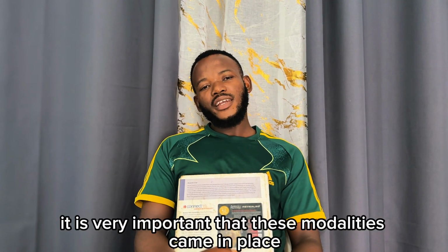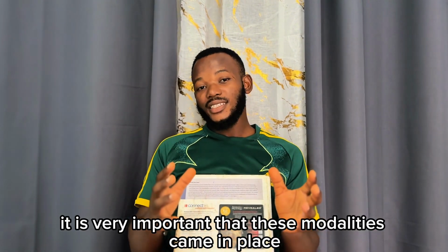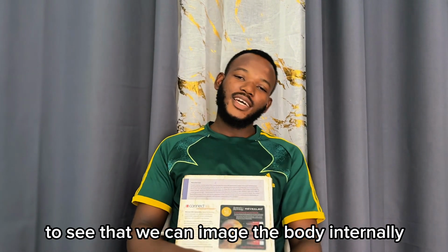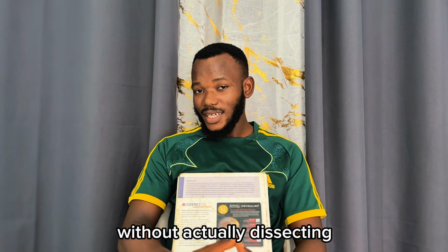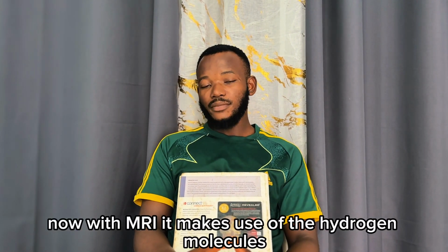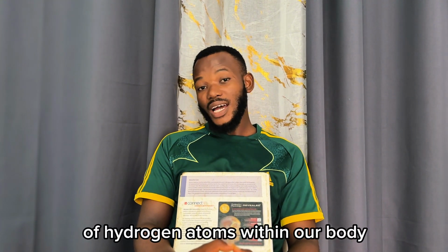So it is very important that these modalities came in place so that we can image the body internally without actually dissecting. Now, MRI makes use of the hydrogen atoms within our body.